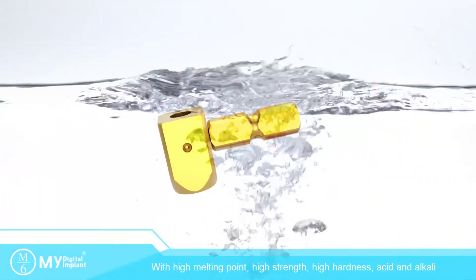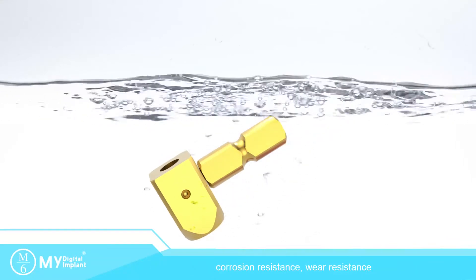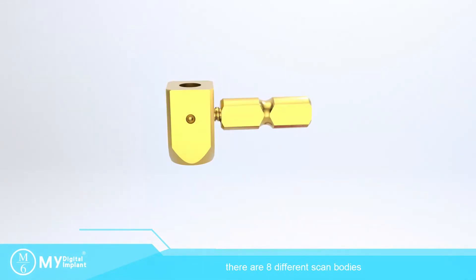With high melting point, high strength, high hardness, and acid and alkali corrosion resistance. Wear resistance. It is safe under repeated autoclave sterilization.